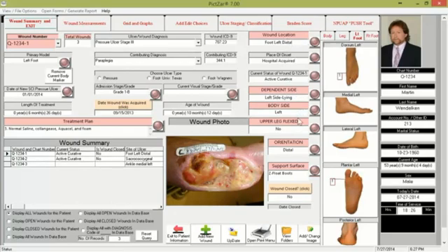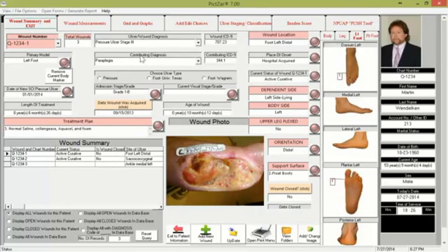The pump parameters are selected here for the wound profile, including the dependent side, body side, upper leg, and flexed orientation. Other fields include treatment plan, support surfaces, wound diagnosis and contributing factor, the place of onset such as an ICU or nursing home, and the date of the new SCI pressure ulcer. This area also ages the wound for you, so you know how old it is and how long you've been treating it. Other fields include wound location and whether you're treating the wound as active or palliative care.